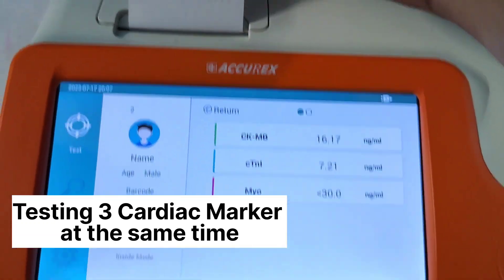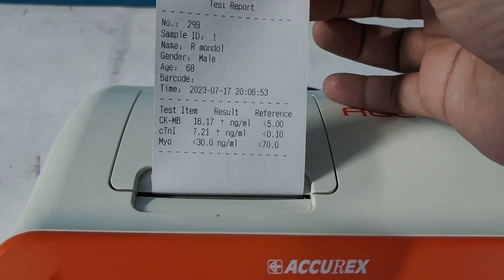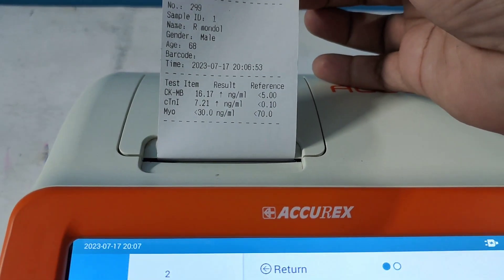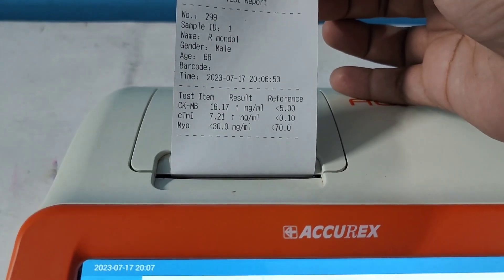By seeing this result, anyone can assume that the patient is having a cardiac issue. It may be myocardial infarction, a heart attack, or may be cardiac arrest.